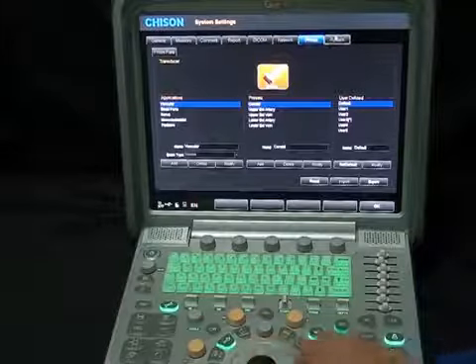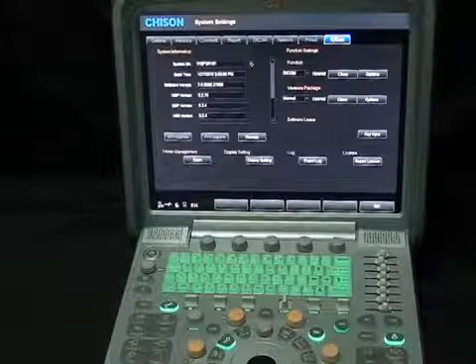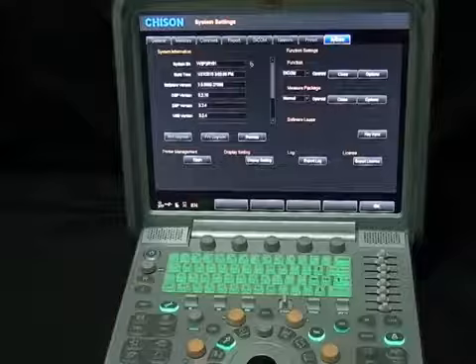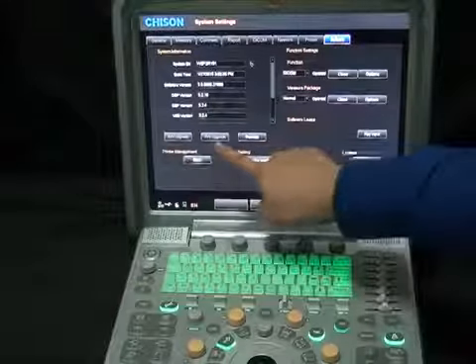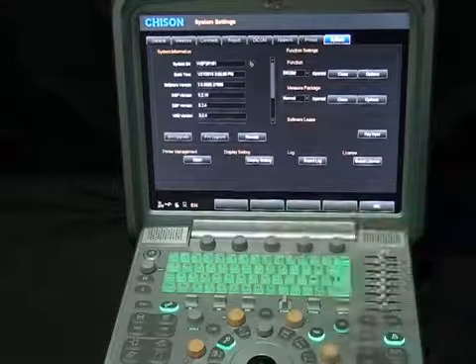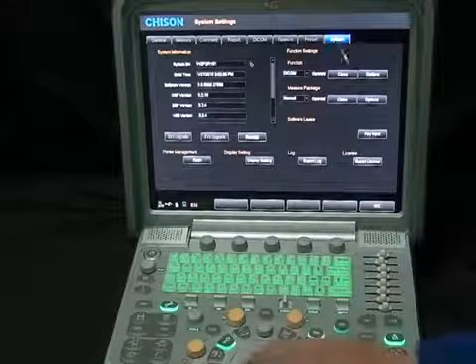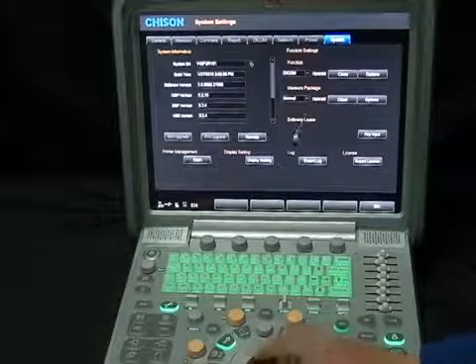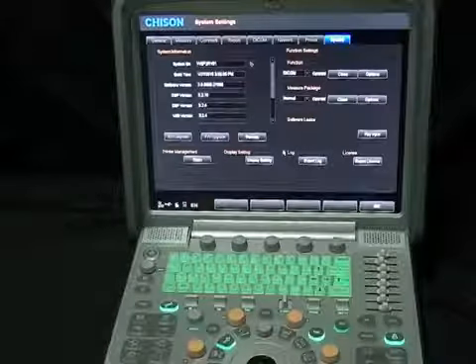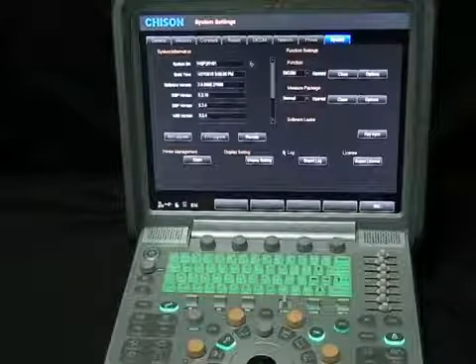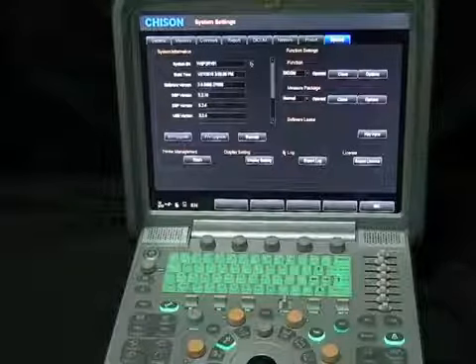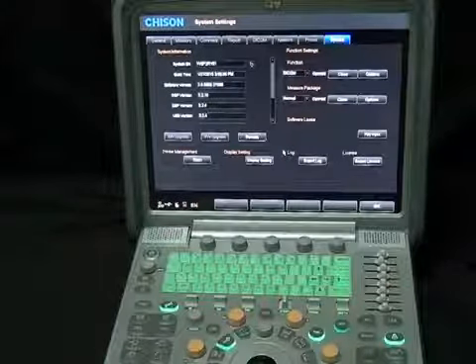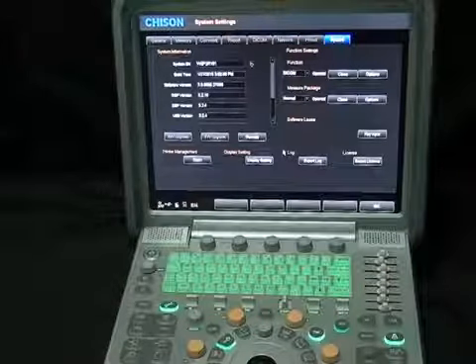The system interface is used for unit maintenance, system upgrade, license control, system lock, and so on. It is worth mentioning that upgrading is quite easy: download the latest software to a USB drive, connect it to the system, it is recognized automatically, press one key, and the upgrade is finished.